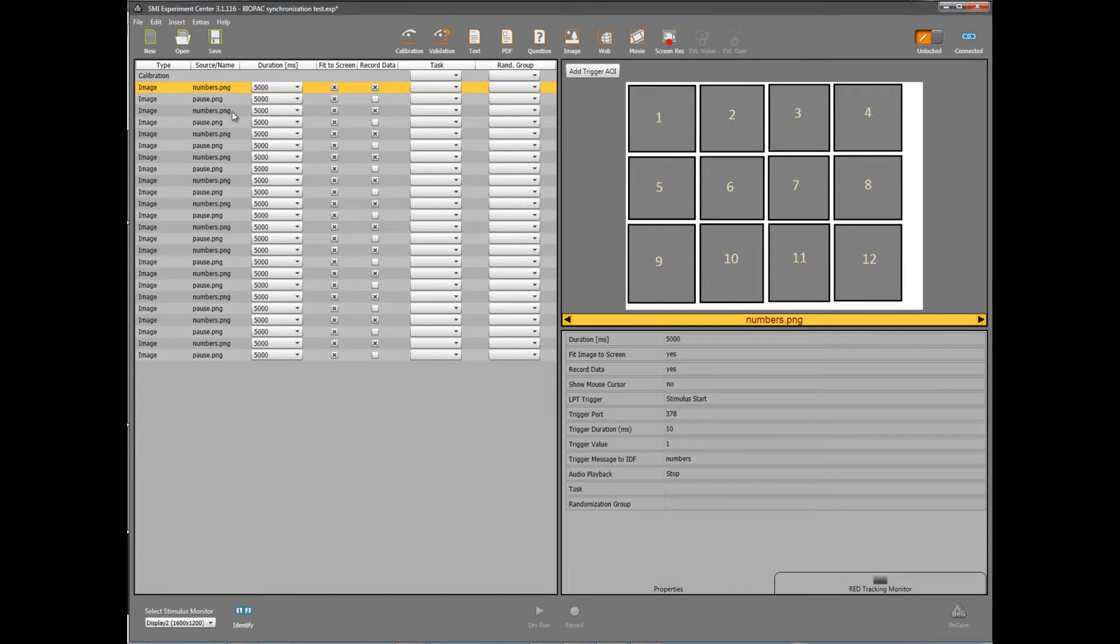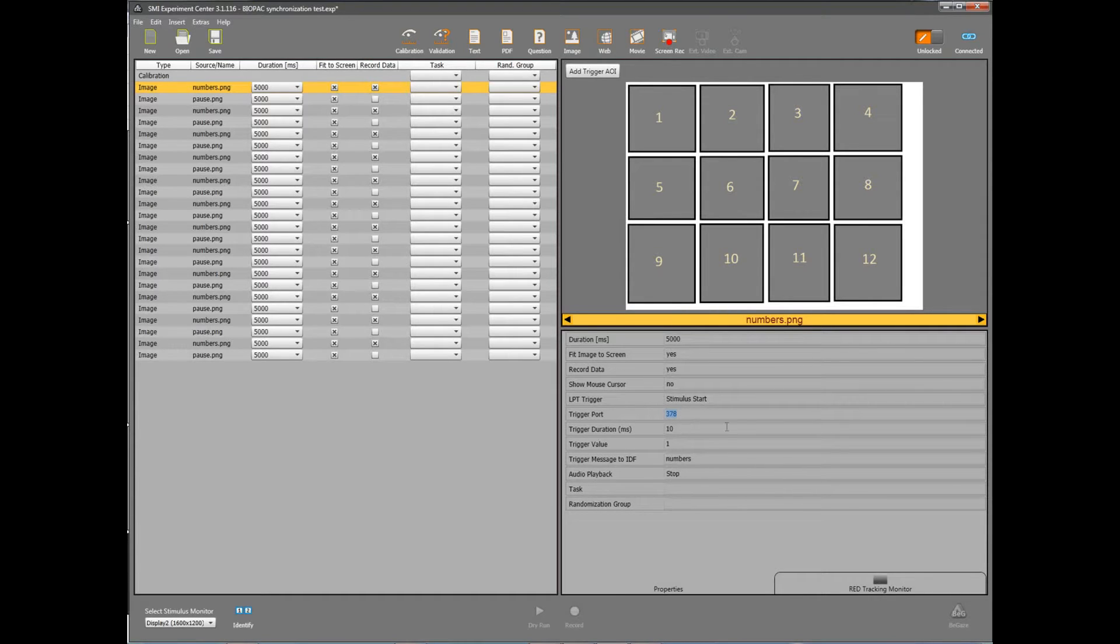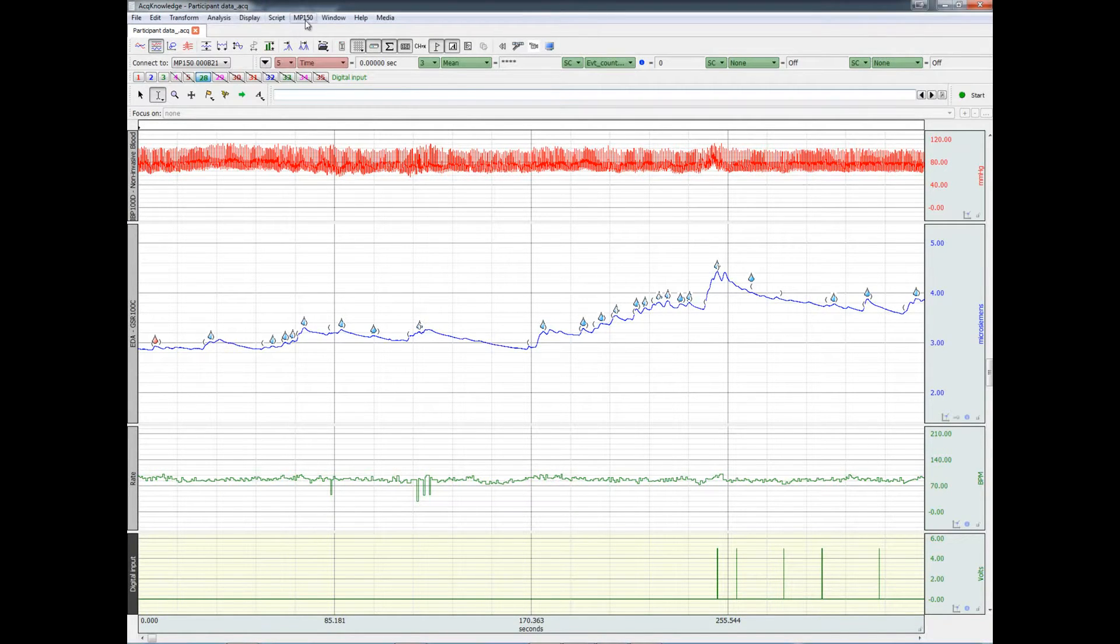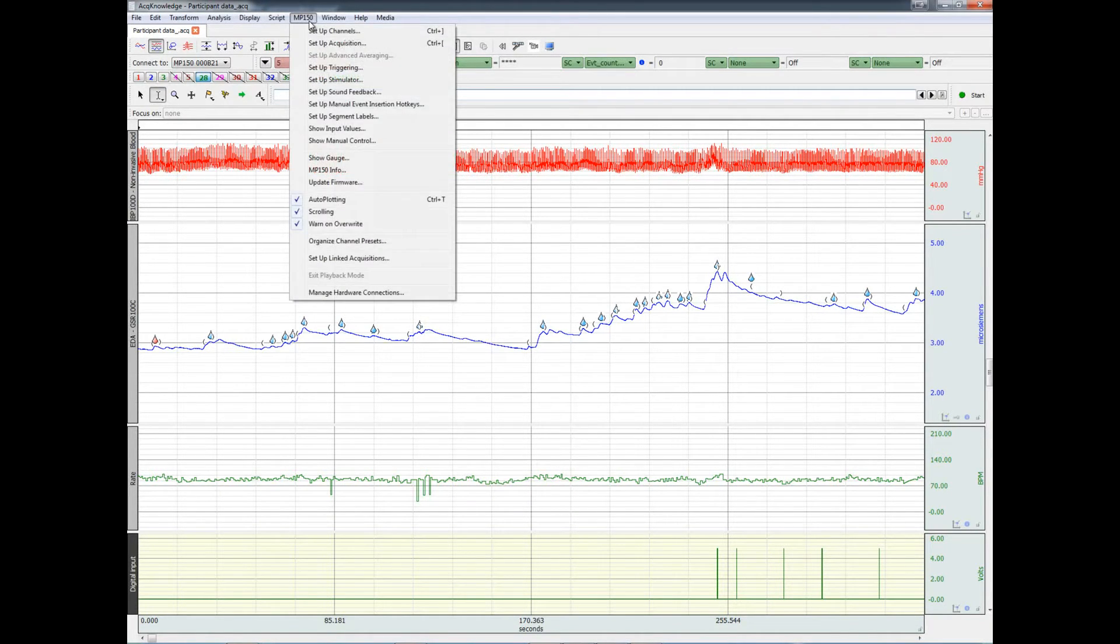In SMI experiment center, make sure to send a trigger via the parallel port at the beginning of the experiment. To record these triggers in ACKNOWLEDGE, enable all the digital channels.